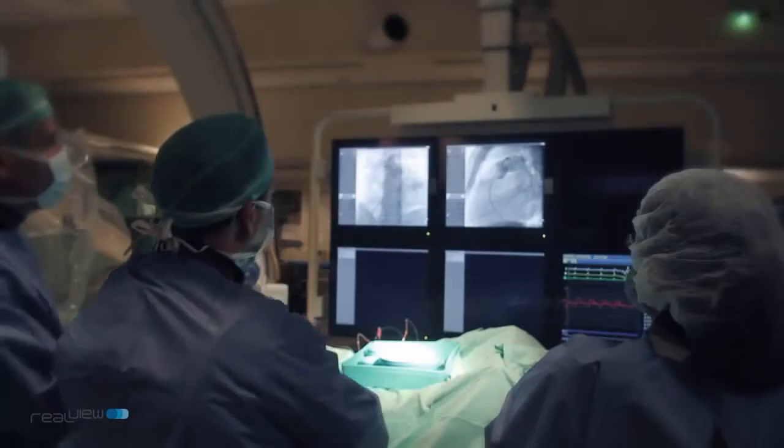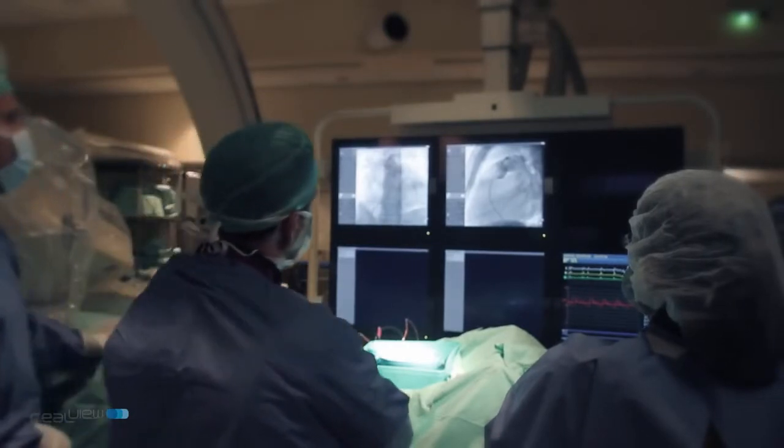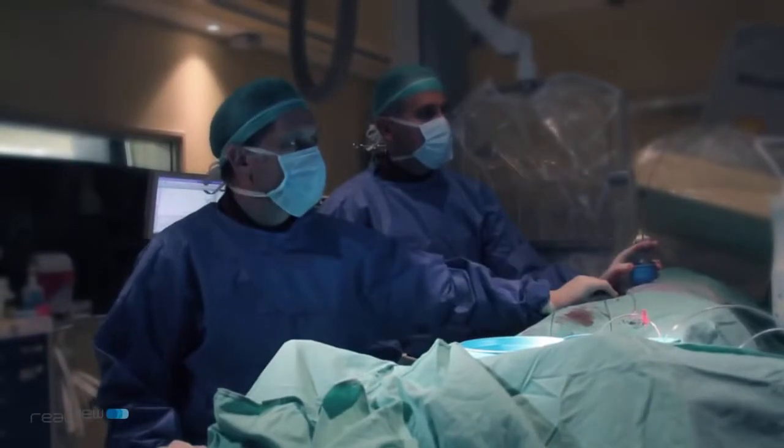As an interventional cardiologist, I depend on medical imaging to guide me through my procedures. The first in-man trials with the RealView holographic system conducted in my cath lab allowed me to actually work with live holograms in a true clinical 3D setting and to explore the unique benefits of a genuine 3D environment.